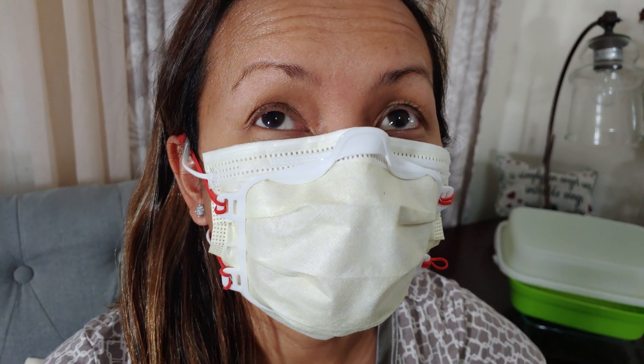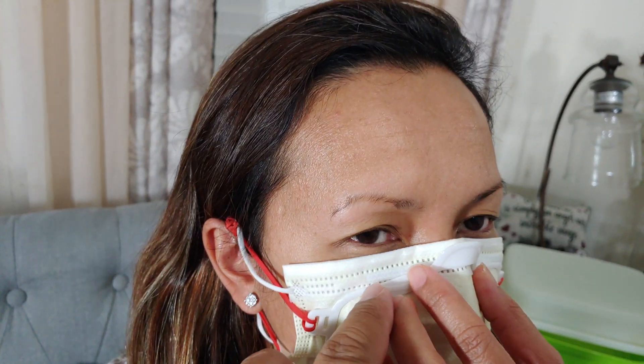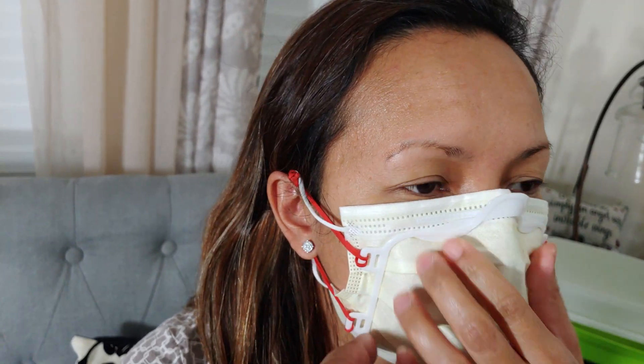I used my 3D printer to print this — I don't know what to call it — to make a better fit and make the mask closer to the face, so it helps seal the corners, top to bottom, especially the nose area.